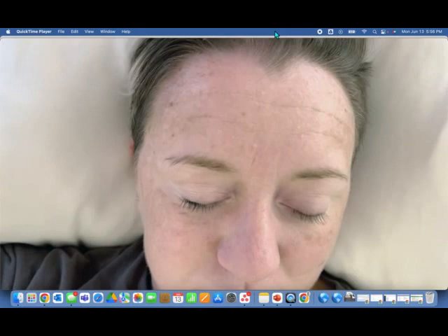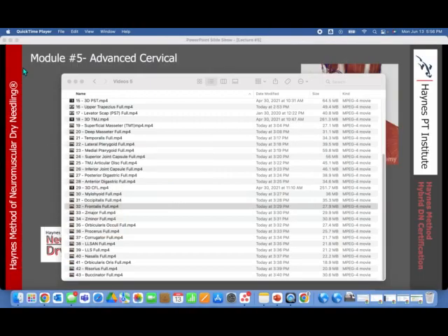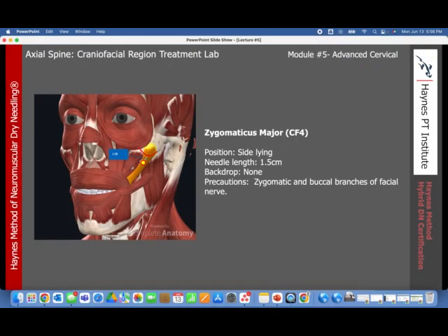Again, that tangential approach to get into frontalis is similar to occipitalis. Has to be very thin. Odds are you will butt up against the skull before you get superficial enough to get into that muscle. Okay, so we'll start in that medial row of the zygomaticus, major and minor, and the levator muscles more closely into the nose.